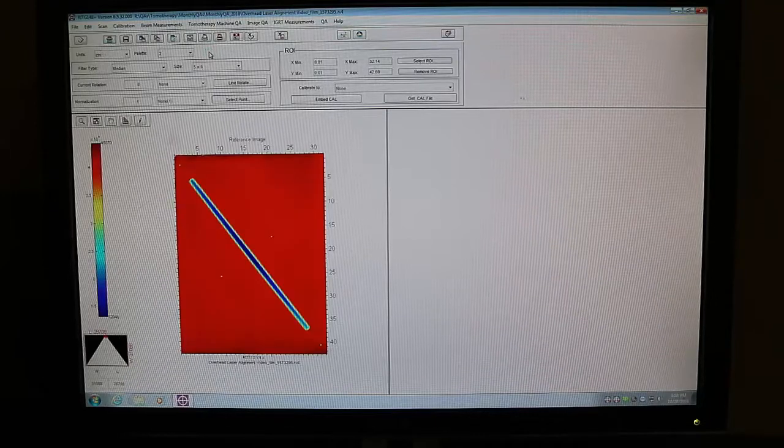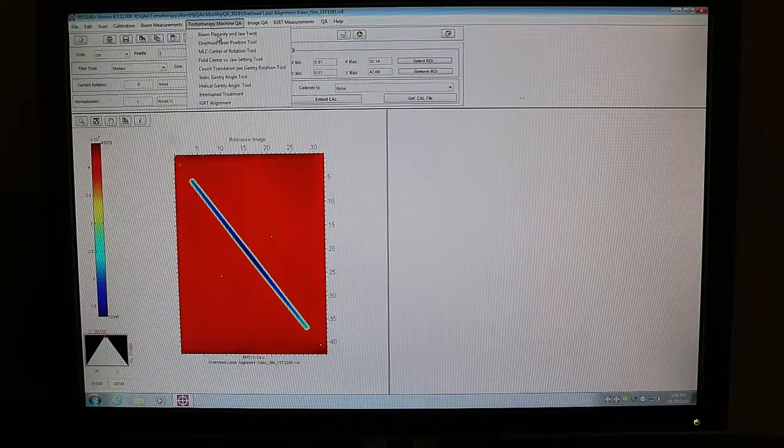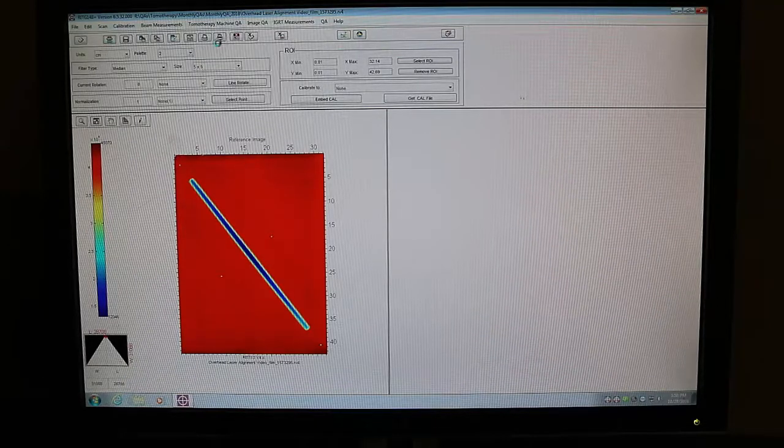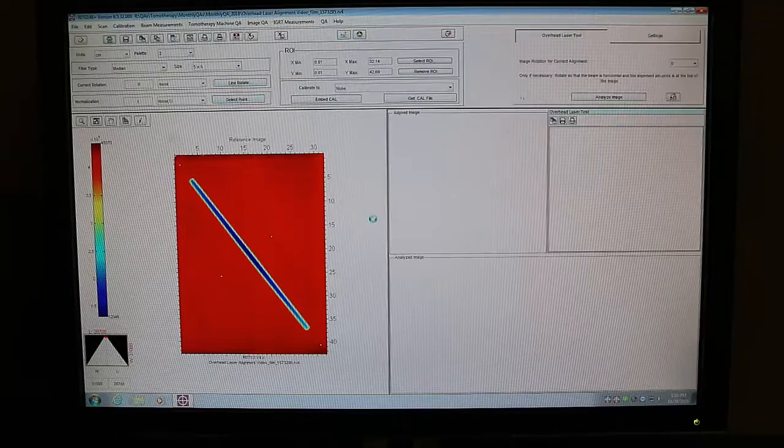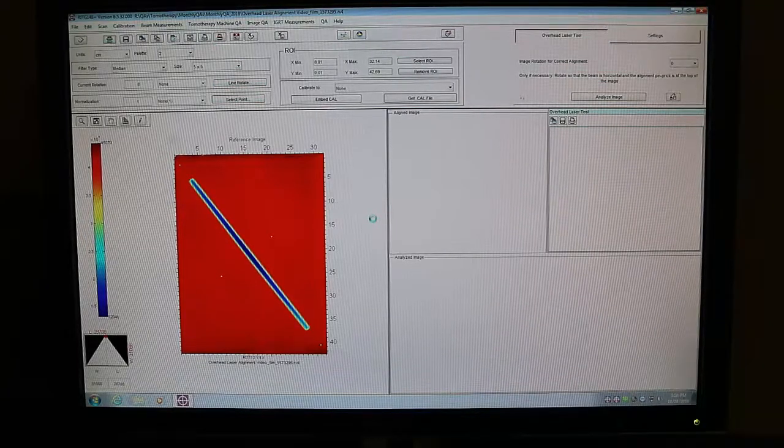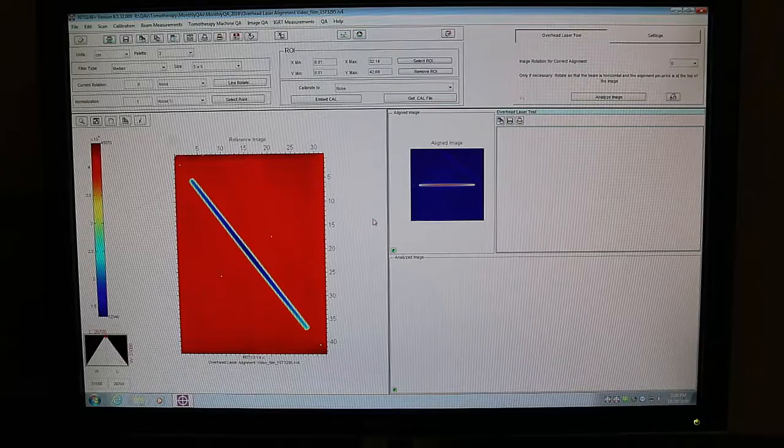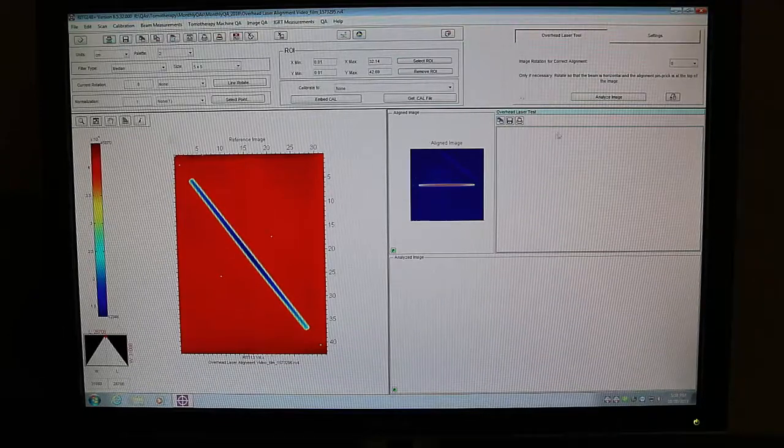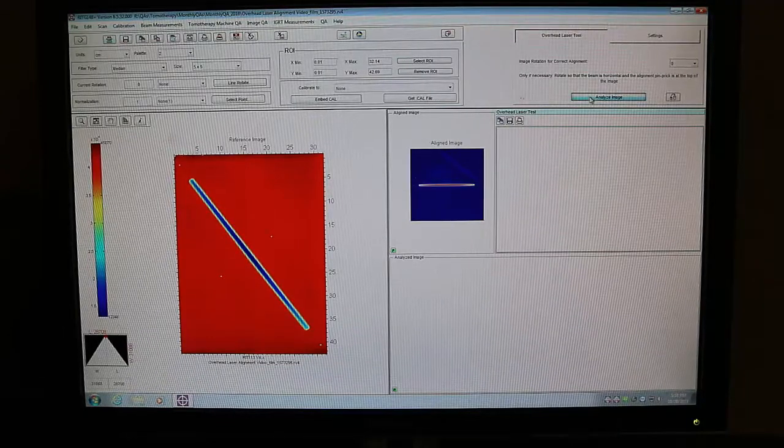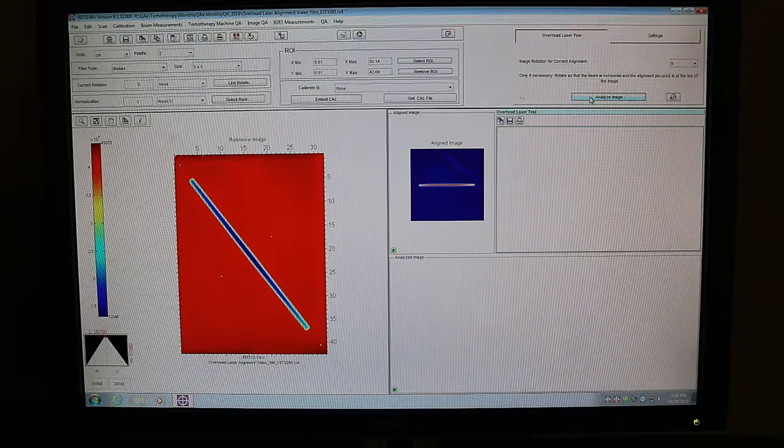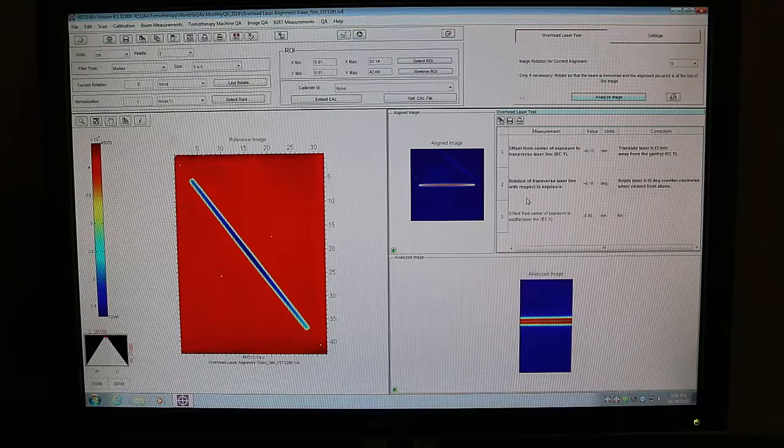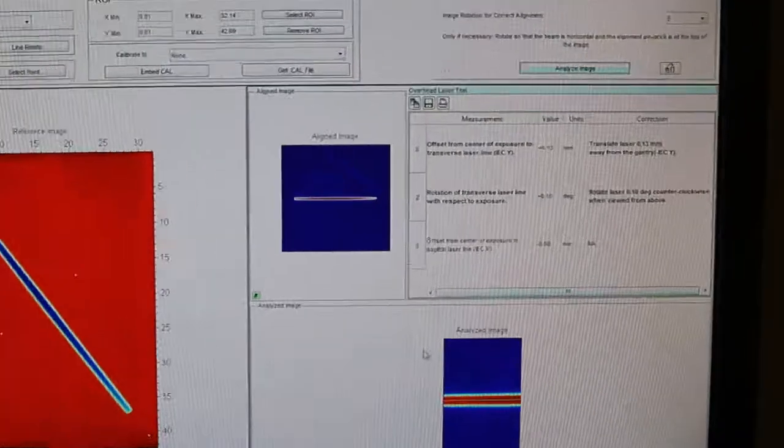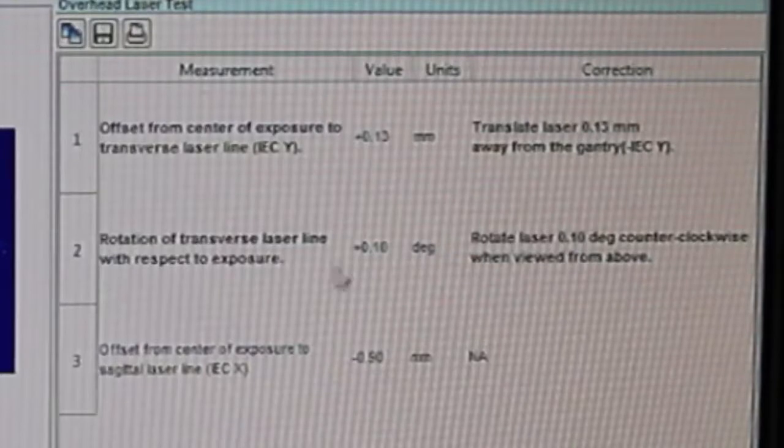Then up at the top menu select tomotherapy machine QA and the overhead laser alignment tool. If everything is going well the software will automatically align the image for you. Once it's done that, click analyze image and it will display the results of the test and that's it, that's all.